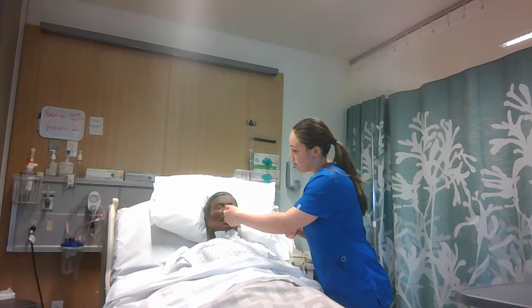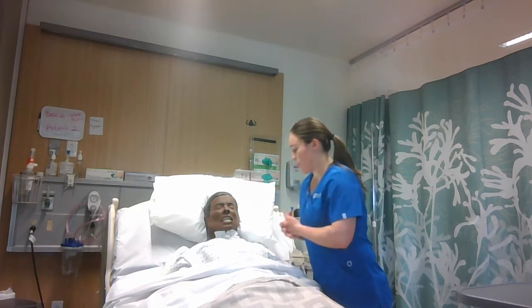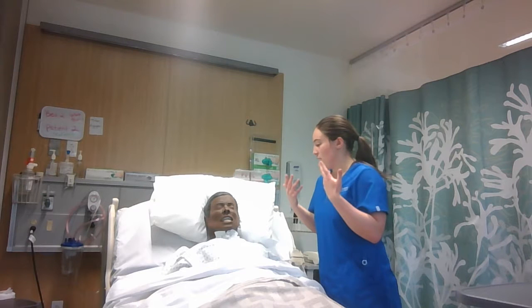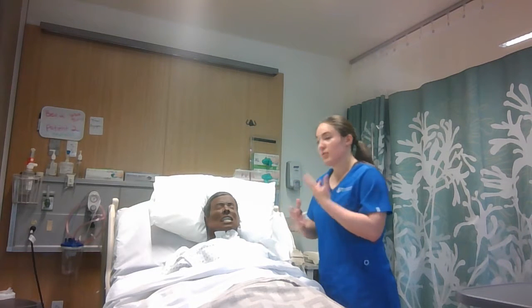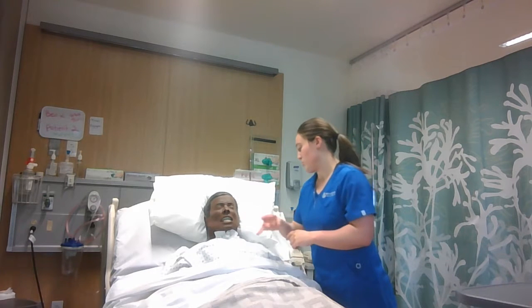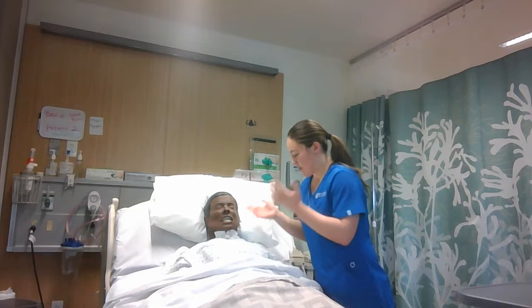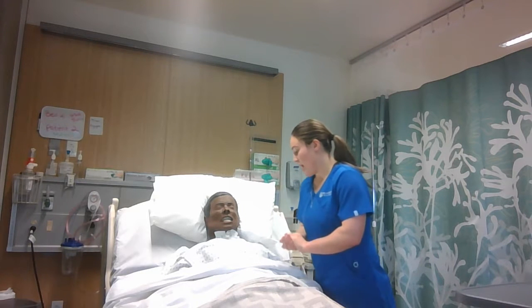I'm going to tell them to take a slow inhale, and as they do that, I'm going to administer one dose. Once they're done with their inhale, I'm going to tell them to hold it for 10 seconds, and then they're going to exhale out through either pursed lips or through their nose. So I would explain all that to my patient, and then have them do it, and then watch them.